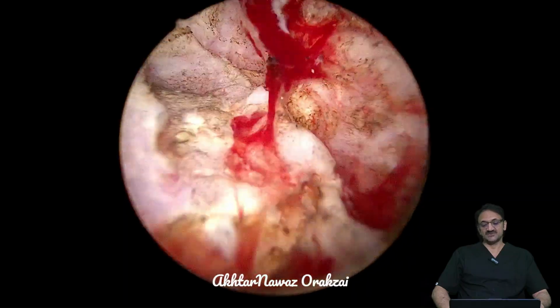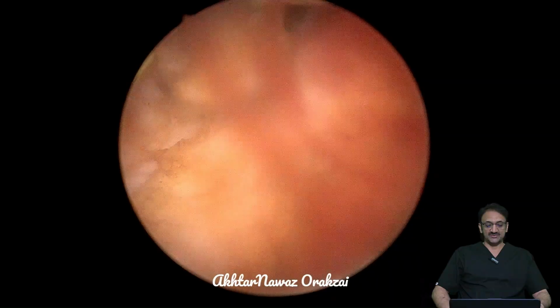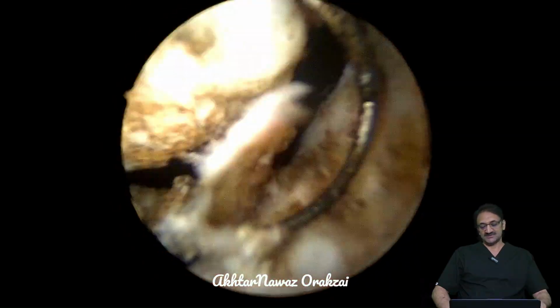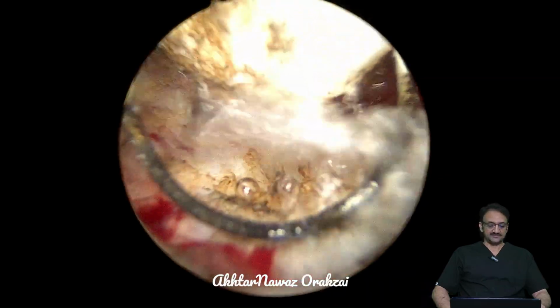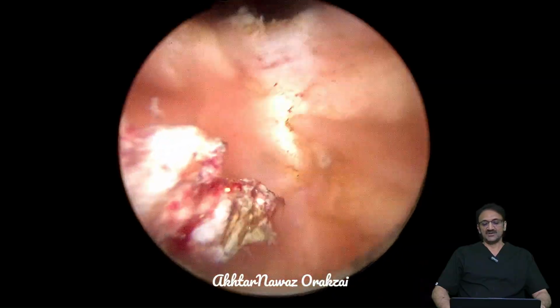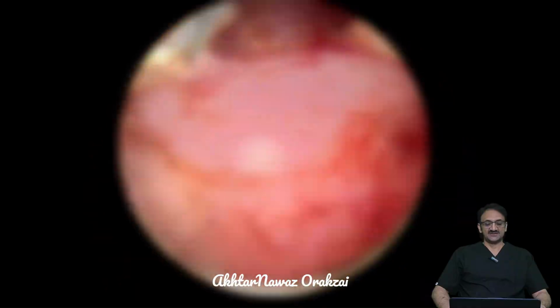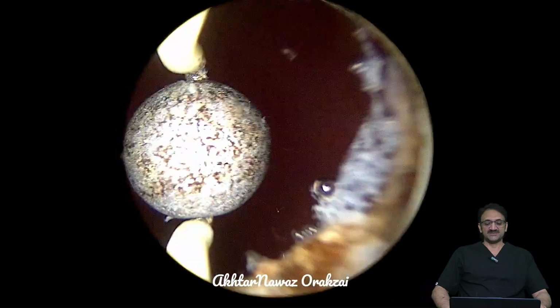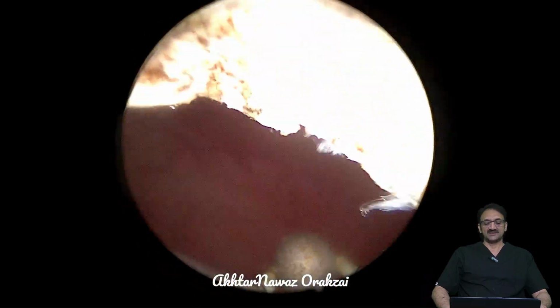Here you can see the capsular fibers, so it marks our limit of resection. So we will not be trying to resect any further. And then after seeing all the cavity and coagulating the large spurting vessels, we found that the procedure is beautiful. I coagulate the bladder neck minimally.